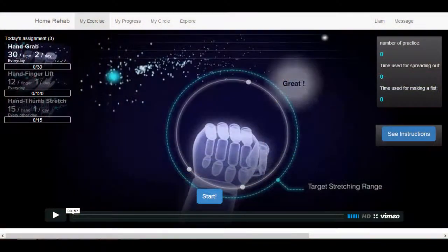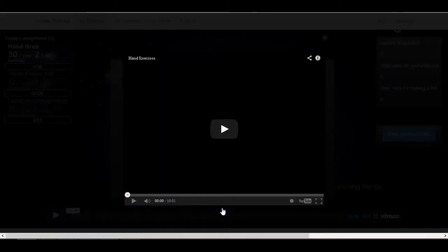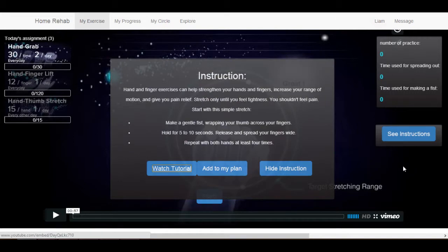Patients can select an exercise to perform. InnoMotion has video tutorials created by professionals that teach patients how to do the exercise. This way, if patients ever forget, they can just review it.